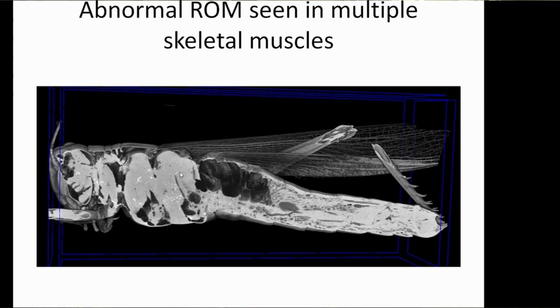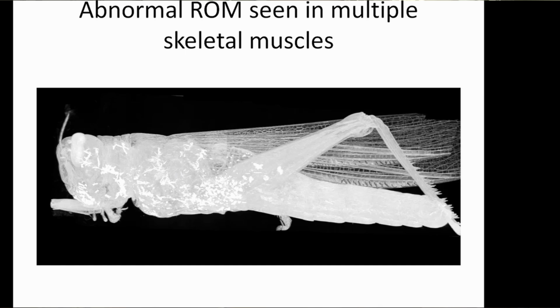These are seen better on a maximum intensity view, and the question for you all, ladies and gentlemen, is what is this appearance due to?